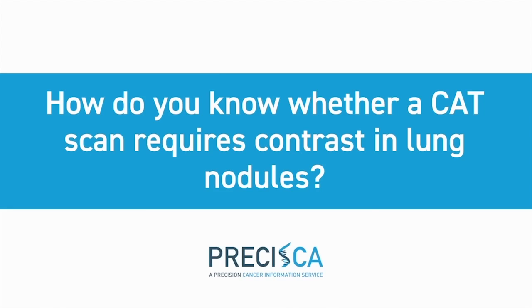The evaluation of lung nodule with intravenous contrast has been studied in the past. And there have been studies looking at the enhancement of a nodule, whether you can predict that it represents malignancy or not. Unfortunately, it's not helpful. So giving intravenous contrast to categorize something as neoplastic is not helpful because inflammatory lesions or infectious lesions can have a lot of vascularity as well and can enhance.